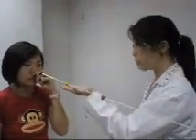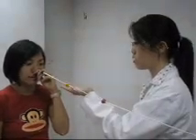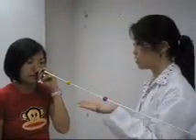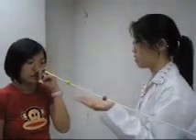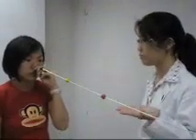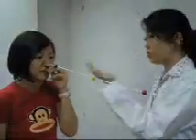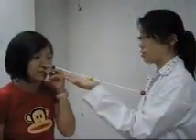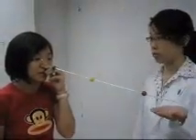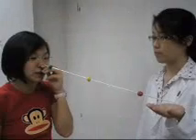Now please focus on the green bead. How many green beads can you see? One. Focusing on the green bead, how many yellow beads can you see? Two. Still focusing on the green bead, how many red beads can you see? Two. Still focusing on the green bead, is the separation between the yellow bead or the red bead larger? The separation between the red bead is larger.